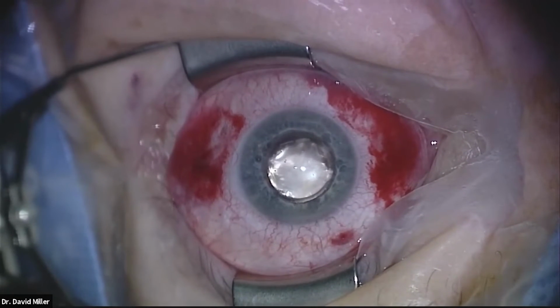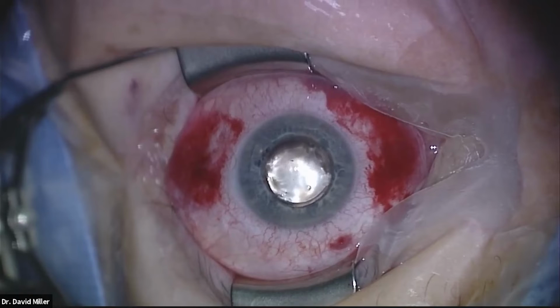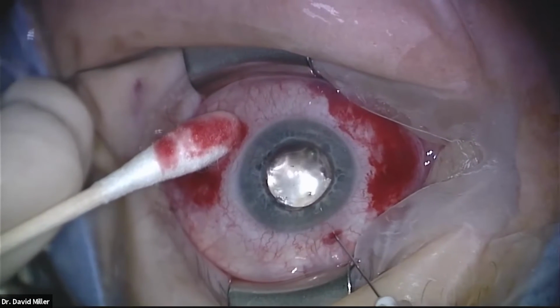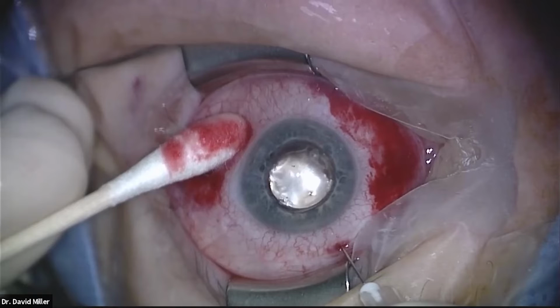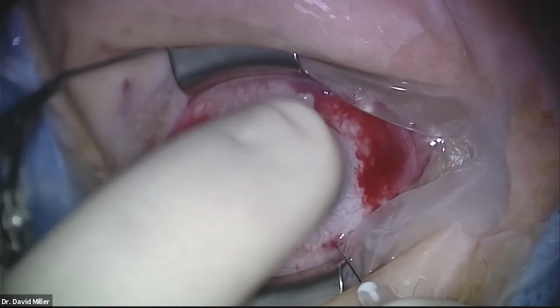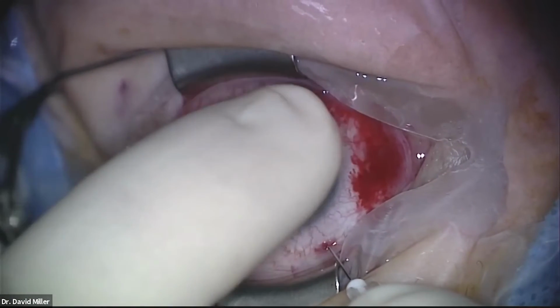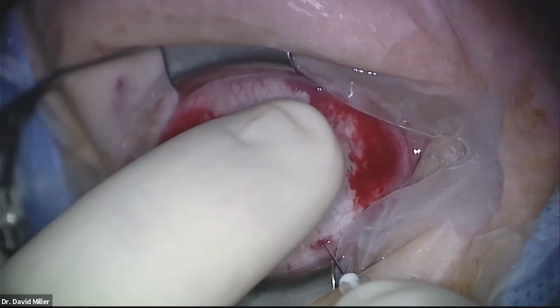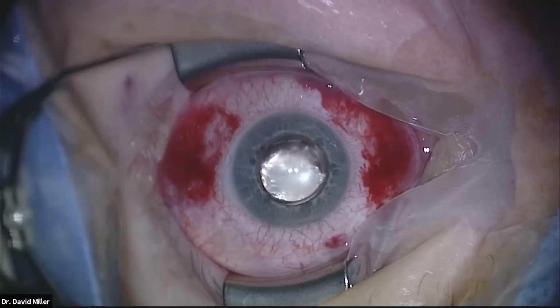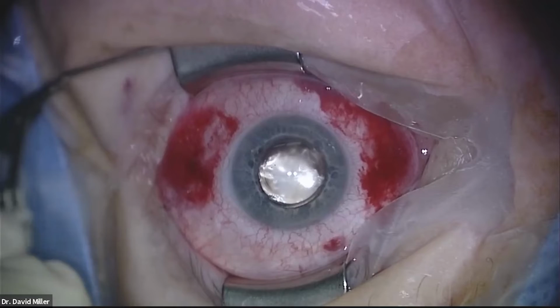Get the gas again. A little firmer than I wanted. There you go. Okay, so no leaks. Eye's nicely pressurized. And that concludes the case.